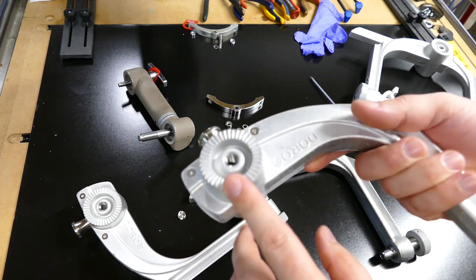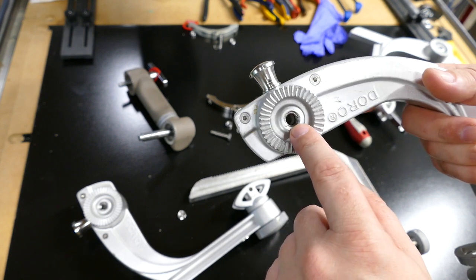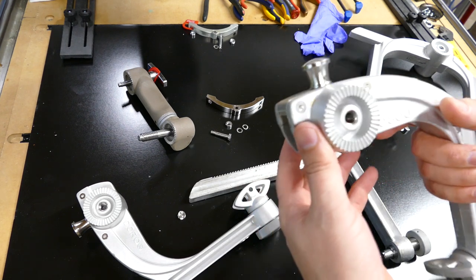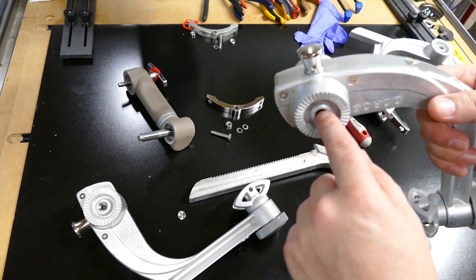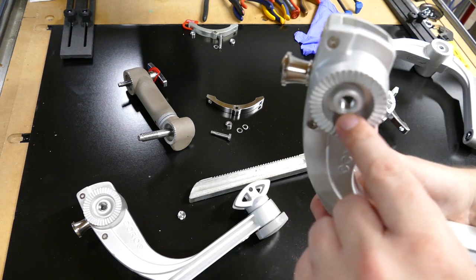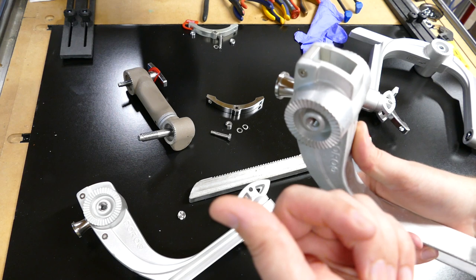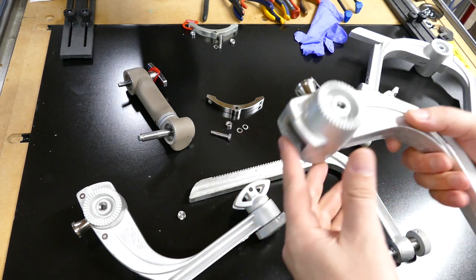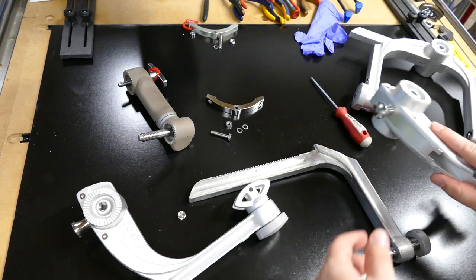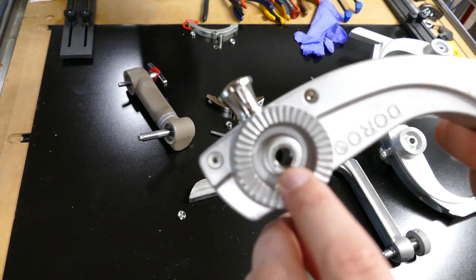Now, on some of these, it's completely fixable. Like on this one here, I want you to take a note that there's a hard stainless insert right here called a helicoil. And on this side, you have soft aluminum. So what the helicoil does is that they take a hardened steel, like stainless steel, and it screws into a threaded hole made in aluminum. You can see the threaded hole right there. This is actually a hole where the helicoil was pulled out because they damaged it. This is a correctly helicoil threaded hole. That one is fixable. This one is not fixable.